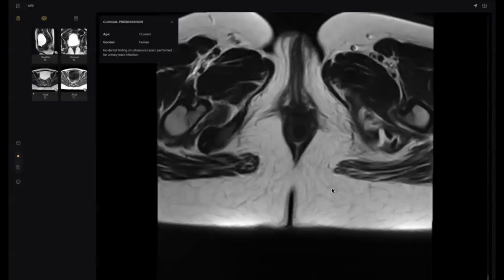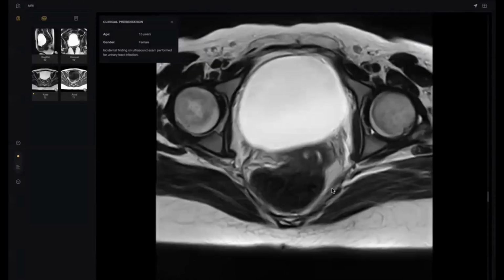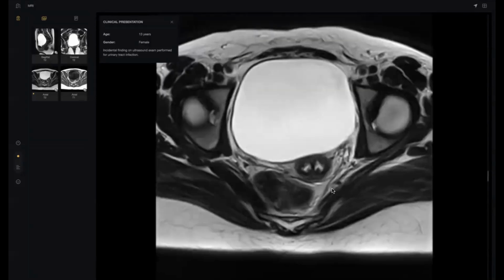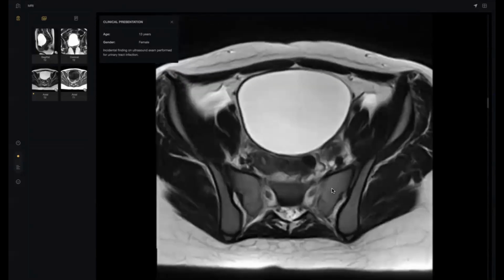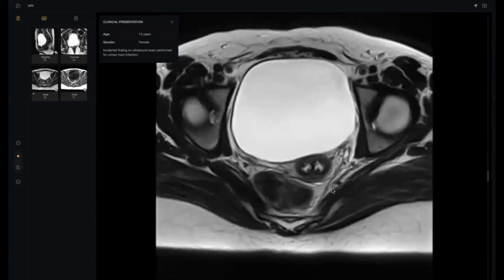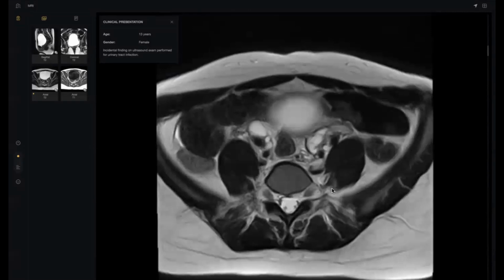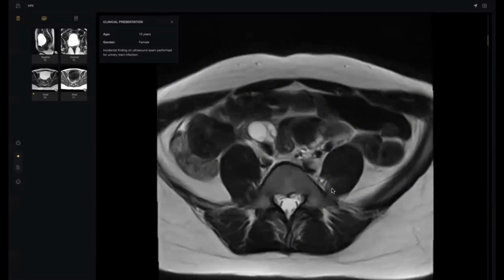So, what's your differential diagnosis? As the patient has uterine didelphys, it is sometimes associated with renal anomalies as well. And keeping in view the distended bladder, I want to look at the bilateral kidneys to look for the status of any renal anomaly. Thank you, doctor, so much. This is the point, yes, that you should do something for the kidneys.